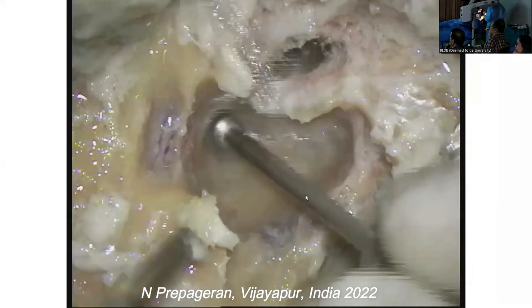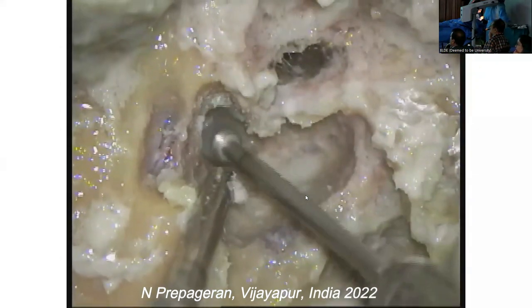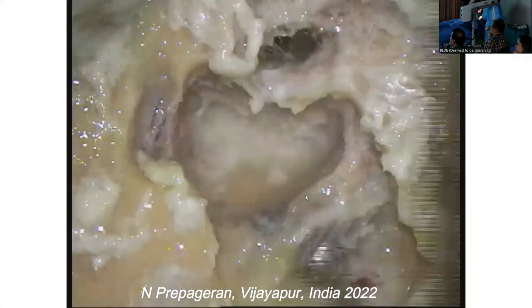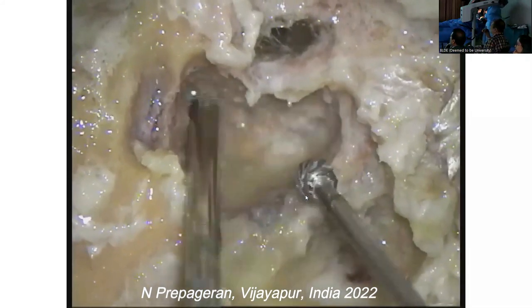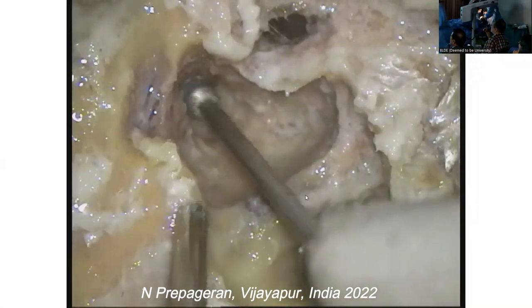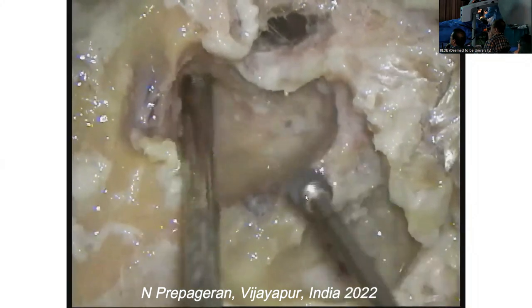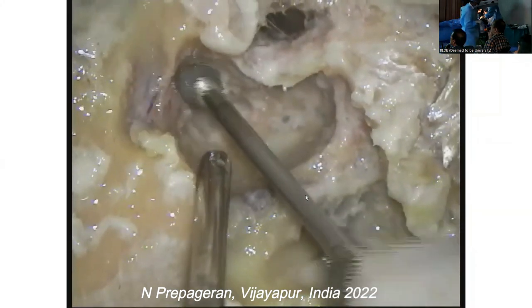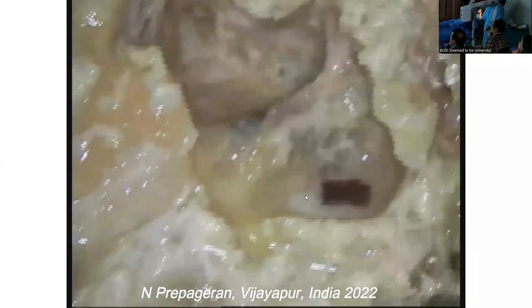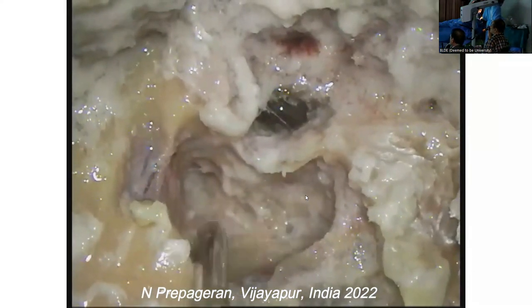Okay, so now, you are now going to cut and expose the ossicles. I think we are about to see the facial nerve. Okay, so let's see. We have a small problem because we can't extend the head anymore. Technically, we need to extend the head much more. But that's probably incus coming into view. Can you hold that? Okay. Can you see lateral semicircular canal now, guys?